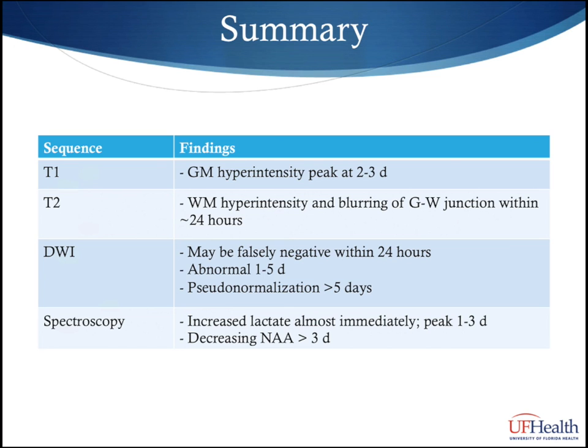Spectroscopy is used to help identify a lactate peak, which in theory is present almost immediately, peaks at 1 to 3 days, and then will begin to normalize. You may also see decreasing NAA after 3 days in the setting of severe injury. As you recall, spectroscopy is generally most helpful in identifying severe versus non-severe injury in the first 24 hours. Beyond this, it is often not as helpful because more reliable findings become apparent on the other imaging sequences.